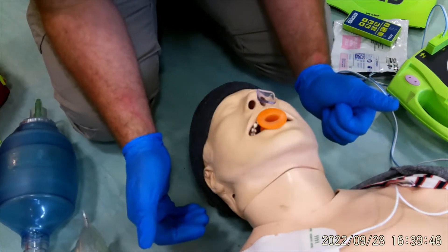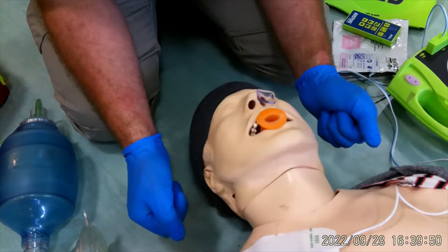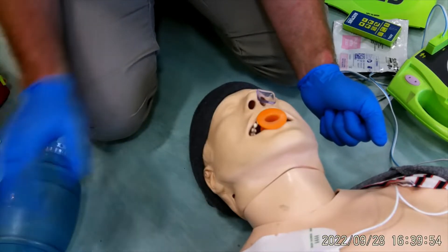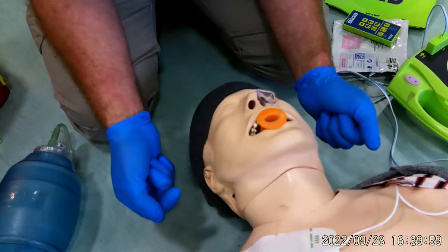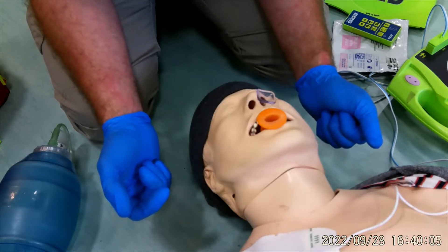Welcome to this video where we're going through our stepwise approach of airway management. We've already been ventilating using a bag valve and mask, we've put a nasal pharyngeal and an oral pharyngeal in, but we want to upgrade to a superglottic airway such as an i-gel.